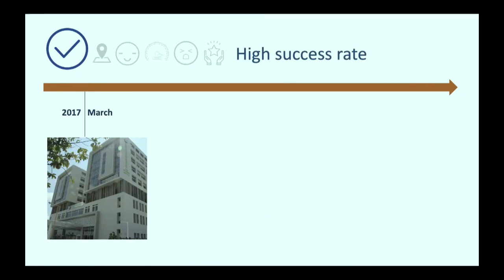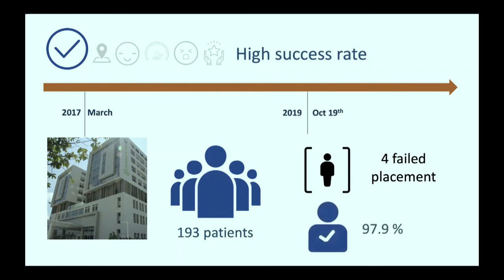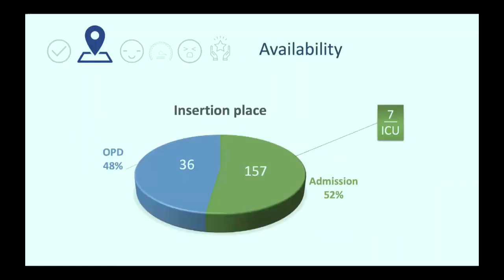We achieved the first performance in March 2017. Until last October, 193 patients received the operation, with a 97% successful rate. It's a high successful rate. And we could do this procedure everywhere: about half in admission, half in outpatient, and 7 patients in the intensive critical care unit. We can do this in critical care patients.